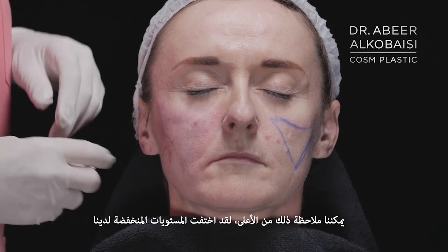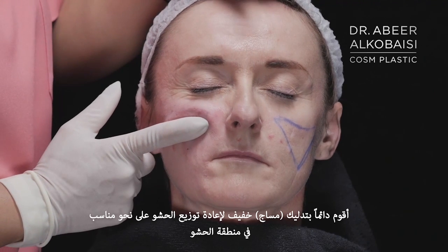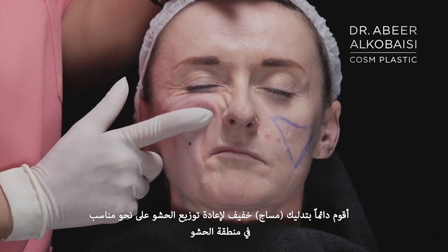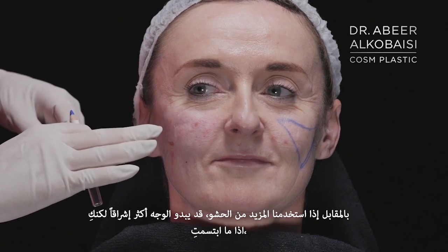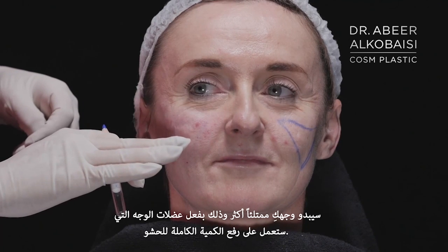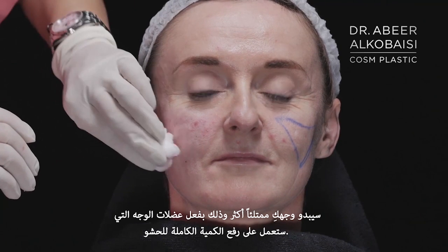So we can see it from top now. The depression has gone. I usually massage a bit just to redistribute the filler in its place. Now if you smile, you can see how the volume has been restored, and it's yet not that big. But if we put more of the filler, again it might look nicer, but when you smile it will give you even more volume, because the muscle will lift up the whole quantity of volume of filler.